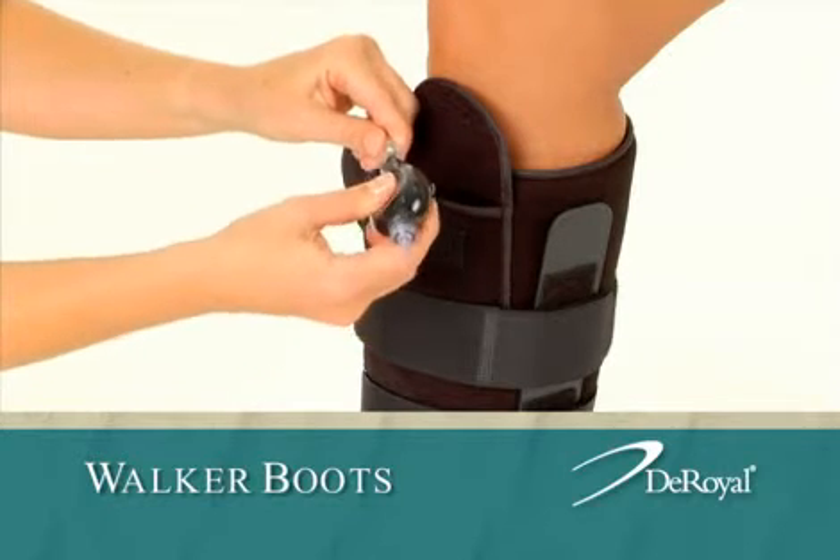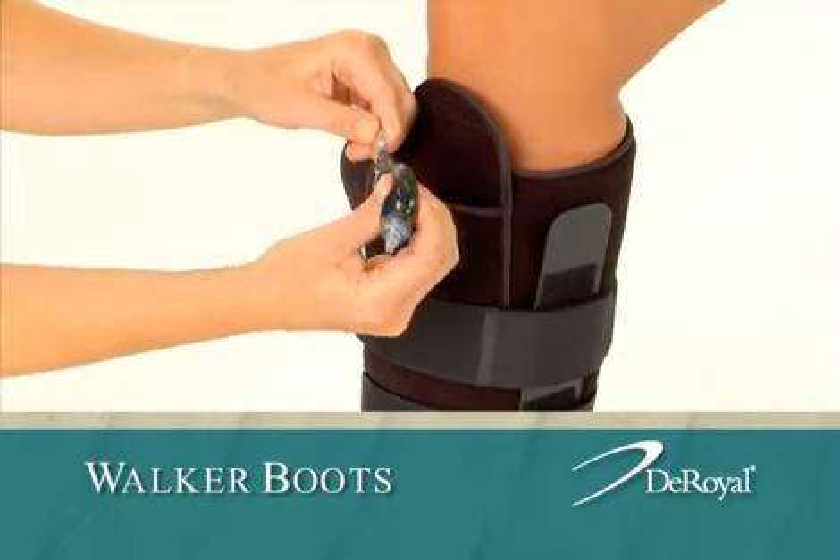To deflate, insert the black end of the bulb into the tube and squeeze.